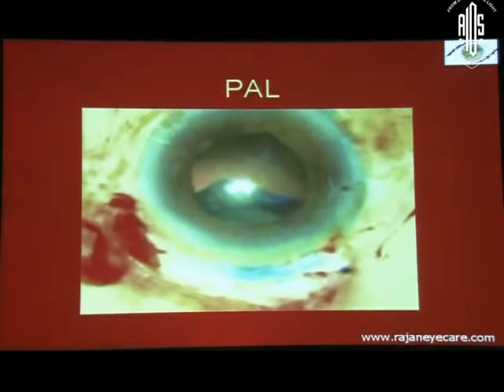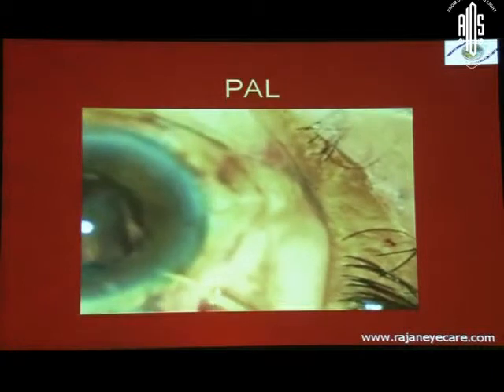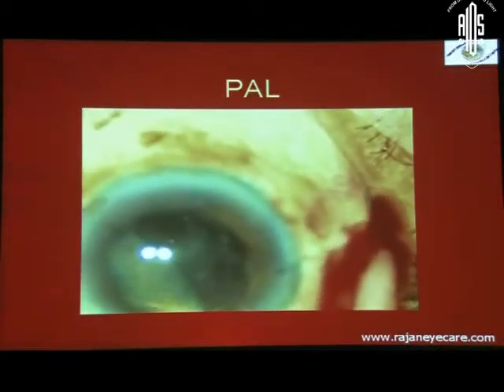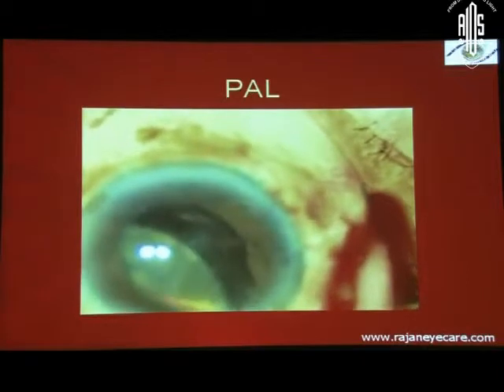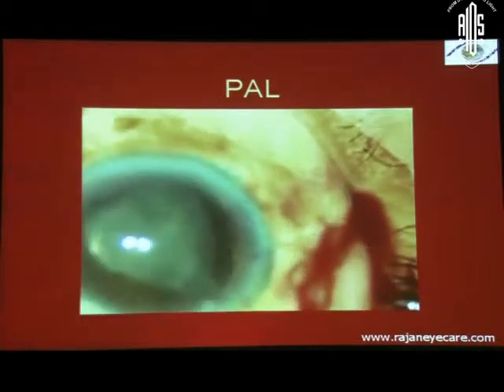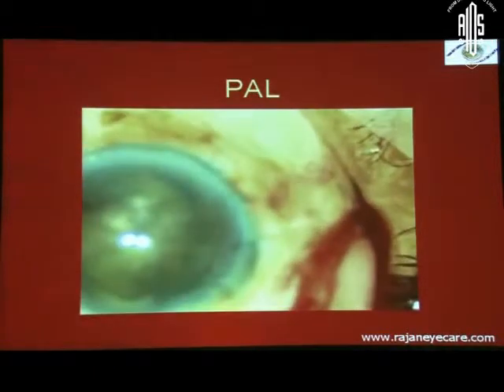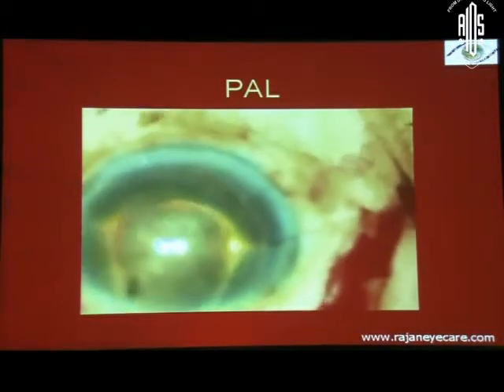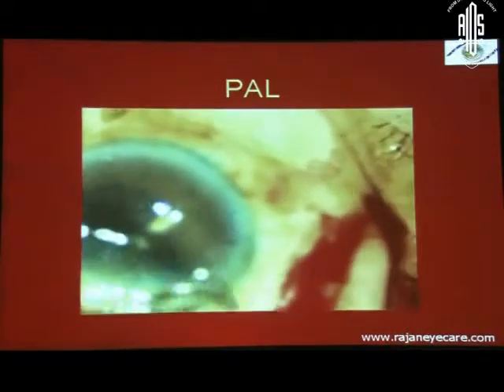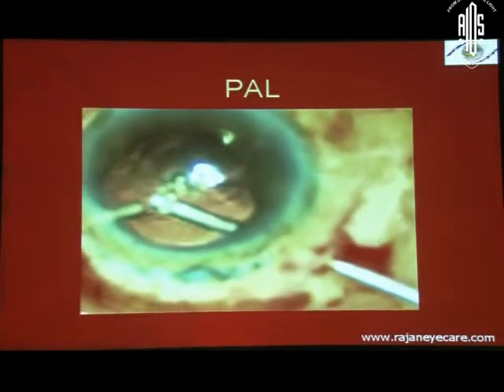She called me from the theater, and I had to go in. When I went in, I saw the picture like this, and then I did an upper temporal sclerotomy, being a right eye, introduced a rod and brought this up. This is called posterior assisted levitation, PAL. So first I showed AL and second I showed PAL, posterior assisted levitation. Only thing is, you should know the limitations of this technique. Make sure that you don't do this in very young patients or very high myopes, because you are damaging or disturbing the vitreous base. The entire cataract is brought out just the way you do an SICS. Then I took this patient up for glued IOL after 3 months, after doing a thorough anterior vitrectomy.